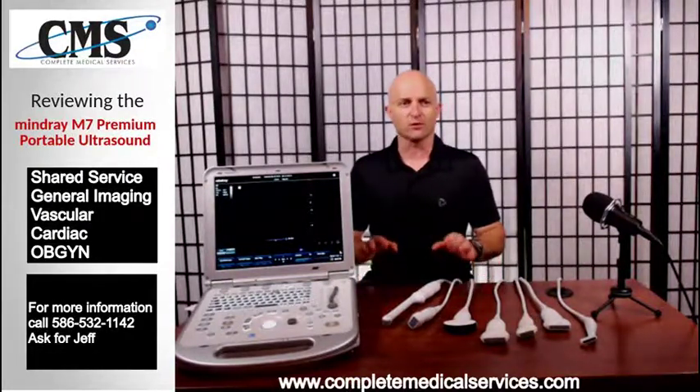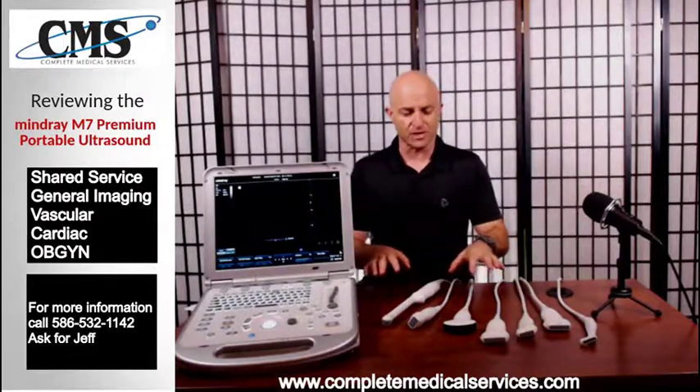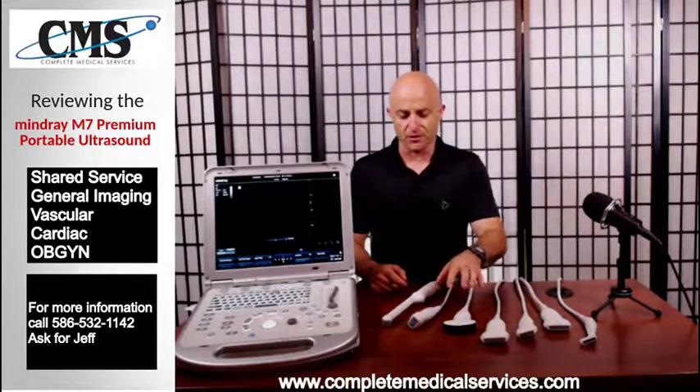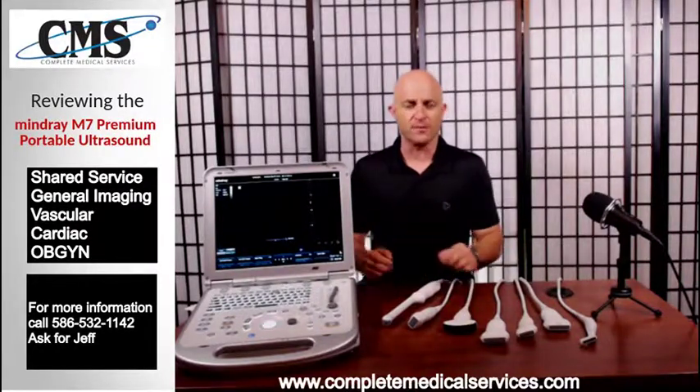On this channel we will discuss everything ultrasound. Today we're going to be discussing ultrasound transducers for the Minray M7. We'll discuss each individual transducer and configurations for different specialties that you may be using the Minray M7 for.